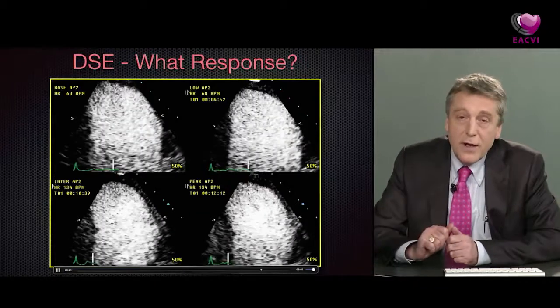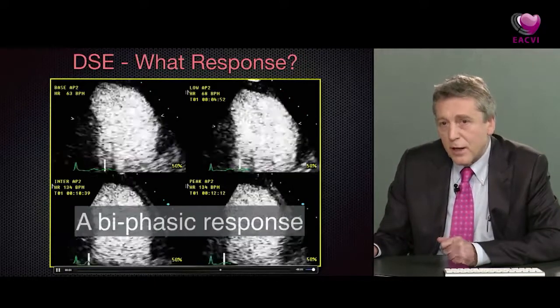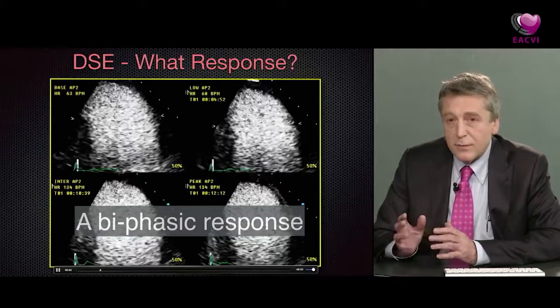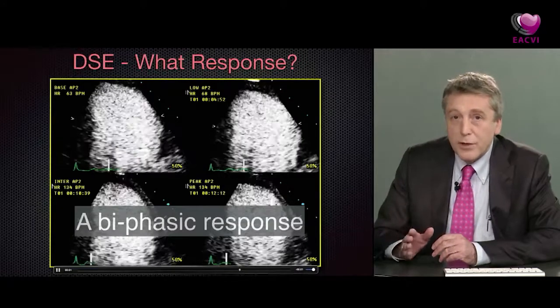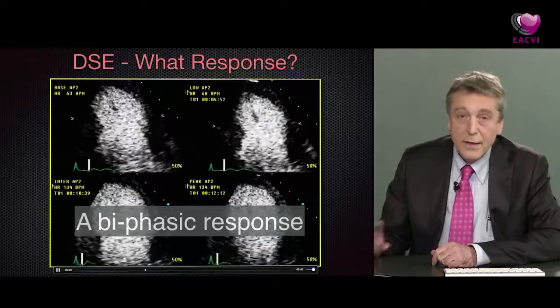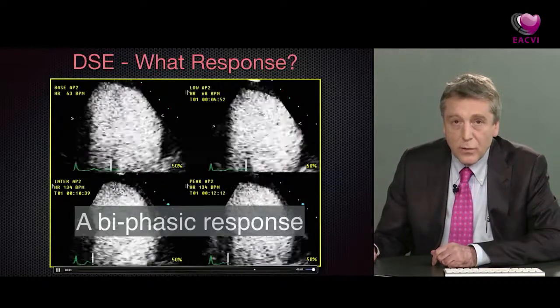This is really very important because it indicates myocardial segments which are at jeopardy and would really benefit from revascularization. And there's some excellent data to show that if these patients are revascularized, they do very, very well. But more importantly, if they're not, they do extremely poorly. So it's a very important finding on a stress echo report. And there's no doubt that contrast helps you identify these subtle changes in wall motion.